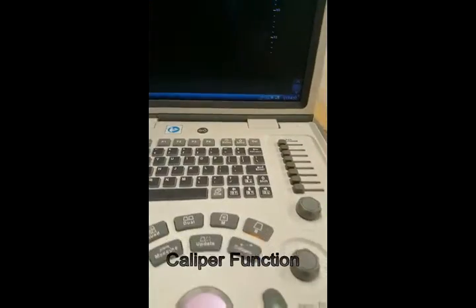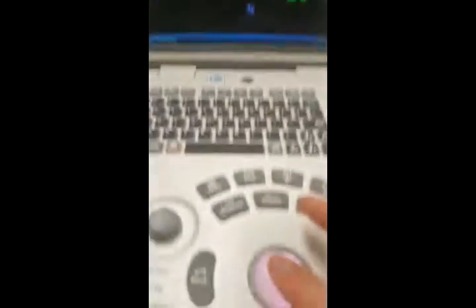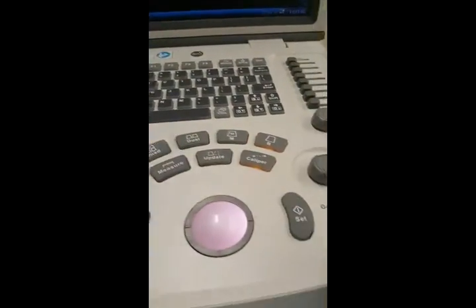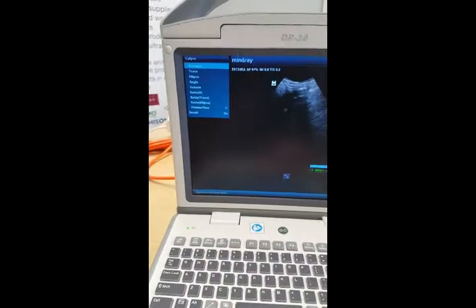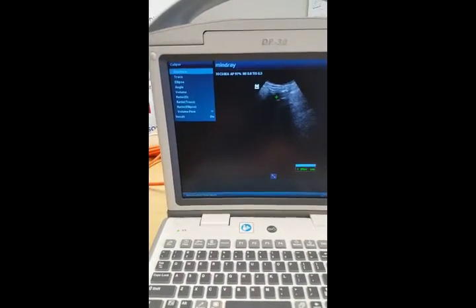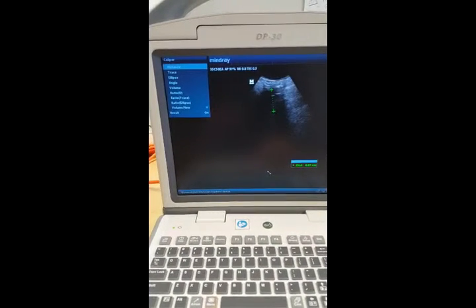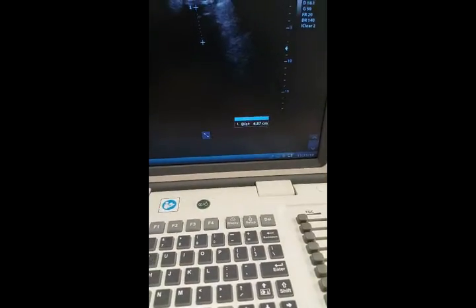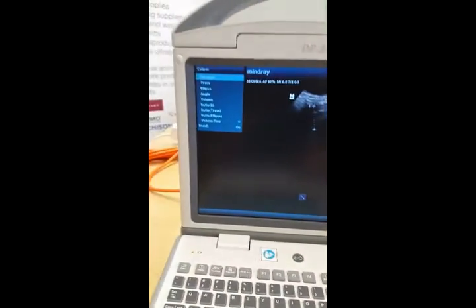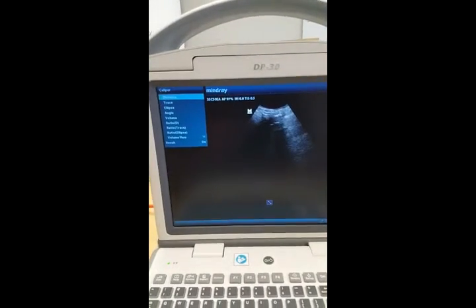The next thing is the caliper button, which is this one here. Press caliper and you'll get the caliper. You move around with the trackball, and then you use the set button to set it. Once you want to measure something — let's say you want to measure that bit there — press set, drag it, set again, and that will give you the distance measured. To escape that, just press back and then clear.